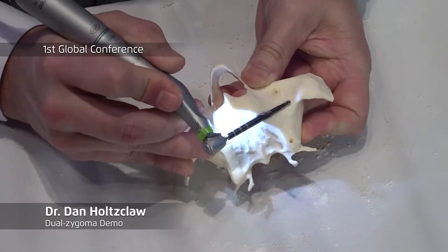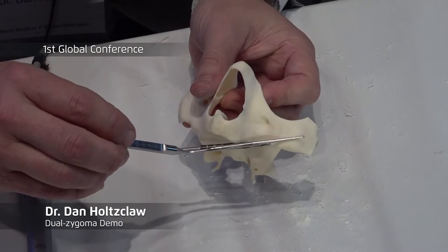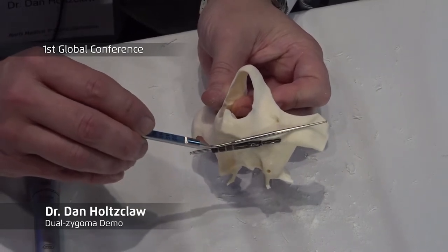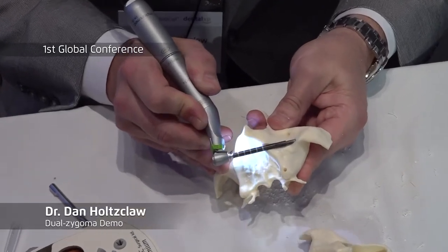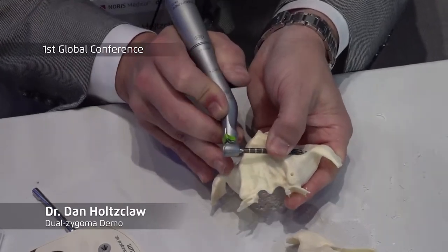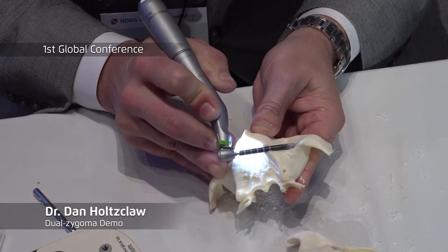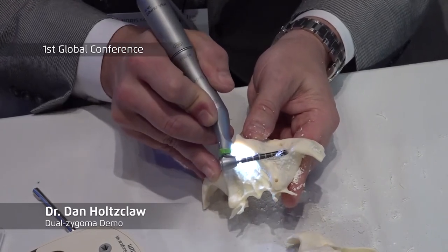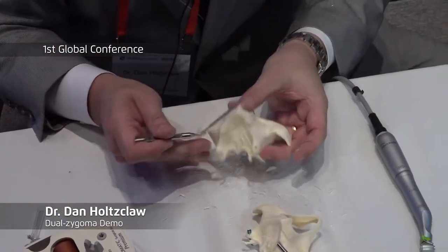You can take something like this measuring device and place it on top of the zygoma, and that will tell you how thick you are in the zygoma — what Jack calls the 'meat,' meaning how much bone you have. This always goes into the same slot. Now I drill, and as I'm drilling I'm stabilizing always in this channel — you could even put pressure on the shaft. This is very dense, almost just like a real zygoma would be. You can see it's just starting to pop out here; I would drill until I felt that pop through.